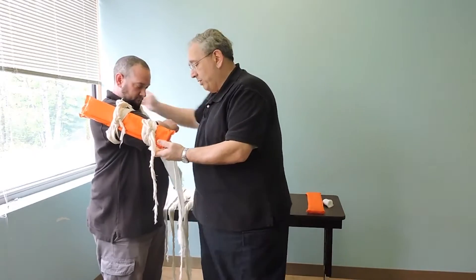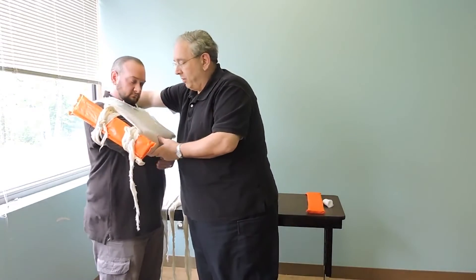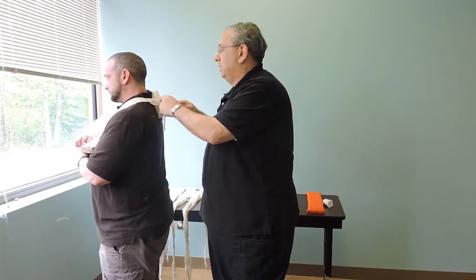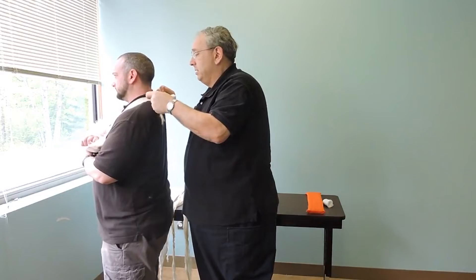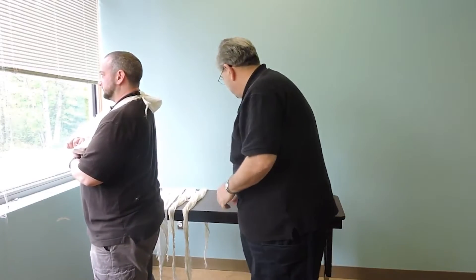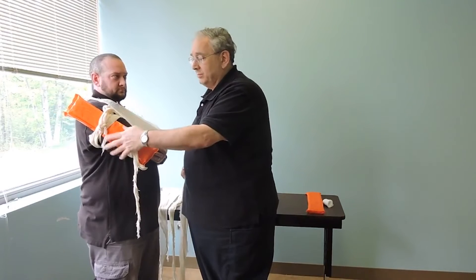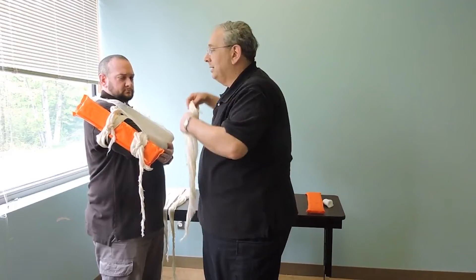I want to come in, grab the elbow with that knot in the cravat, come up over the shoulder, pad the knot, put that surgeon's knot in again, double tie it. Then I'm going to do a swath — across. It's okay if it comes across here because it's on the board; it's not actually on the injury.